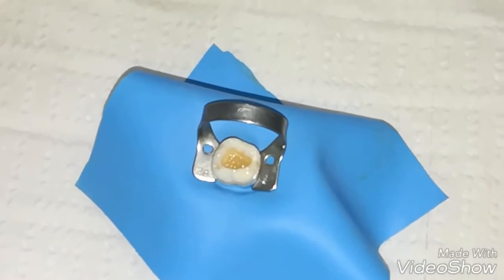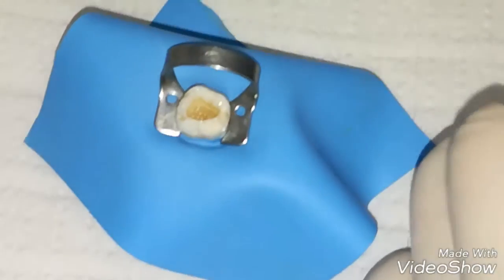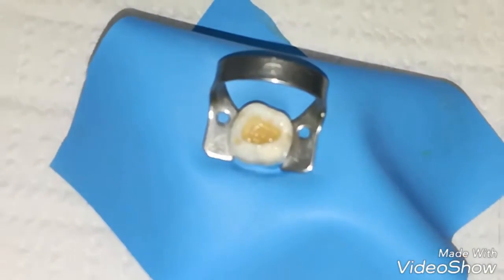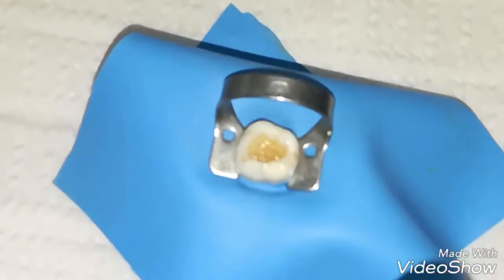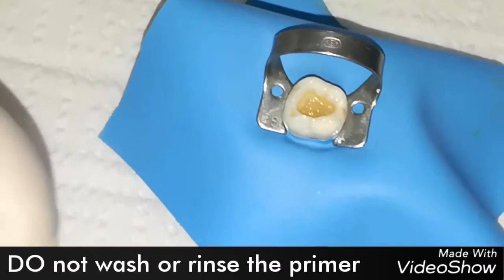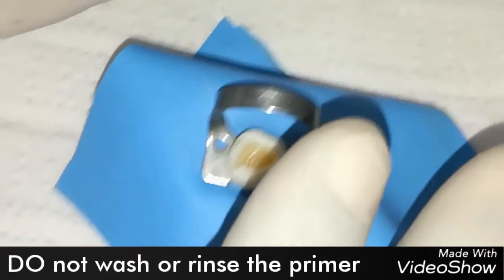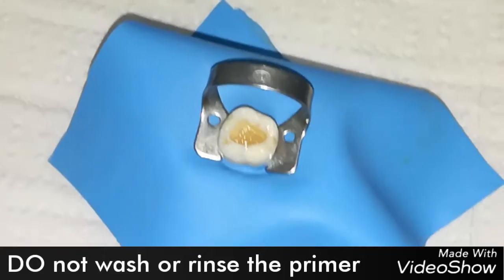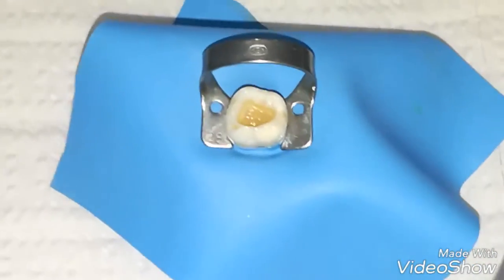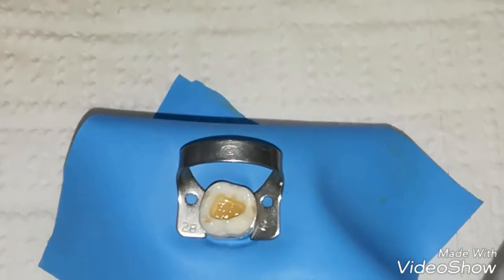The 20 seconds is up. Now the decalcification of calcium hydroxyapatite from both enamel and dentin has occurred. The tooth is ready to take the bonding materials. As we use Clearfil AC Bond, there is no need to use any kind of water or rinse after using the primer. Leave it with the primer because it has the unique MDP monomer. When we use the bonding material, it will replace the primer on top and after we apply a little air, the primer will bond in.